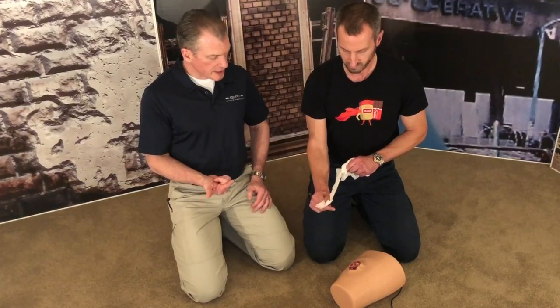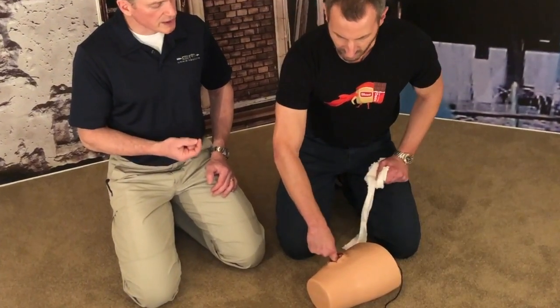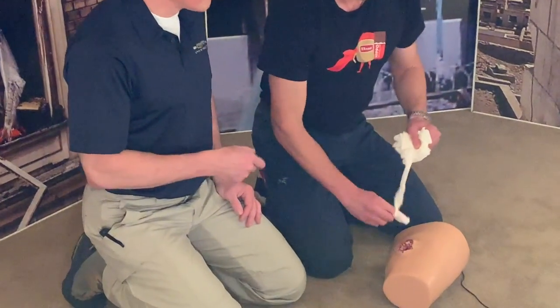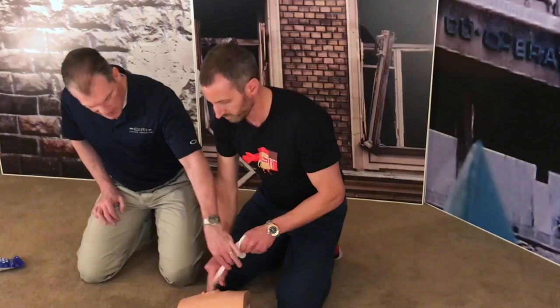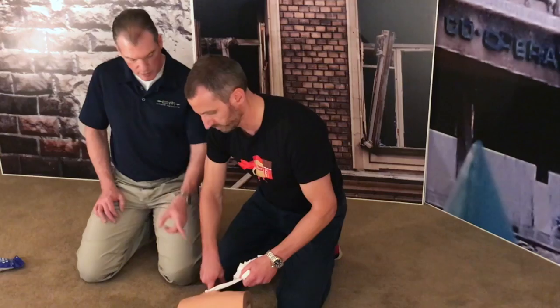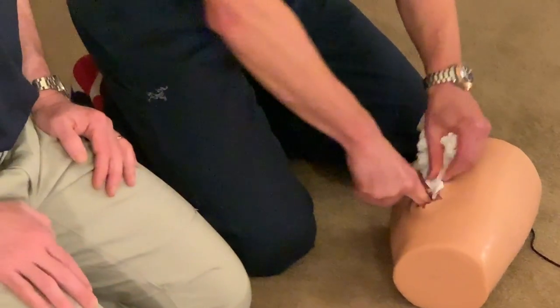Step one: identify the point of bleeding. Stick your finger in the hole, because you may have blind channels, little fascial planes — and it'll feel like a squirt gun on your finger even while you're wearing gloves. Bleeding has stopped; I've got my finger on it right now. I'm going to have to take my finger out. Then lay some gauze over the tip of your finger, a small wad, shove it directly back to the point of bleeding, and then feed yourself about six to eight inches of gauze — not too much — and then hand that length of gauze to yourself to shove it in.